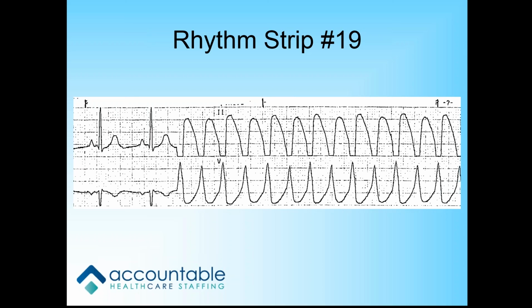You could cardiovert, yes. What's a drug you could give me? Amiodarone. Very good. What would the dose be? Is it still 300? It'd be 150. Okay. You've got a beating heart, so you cut it in half. Oh, okay. Perfect. Good job. Next.